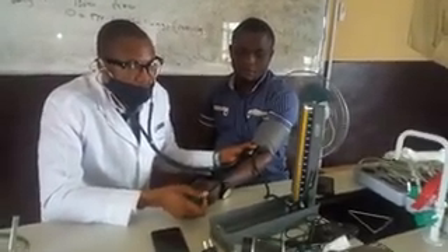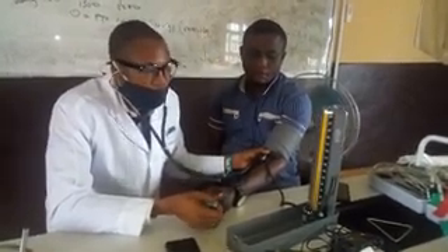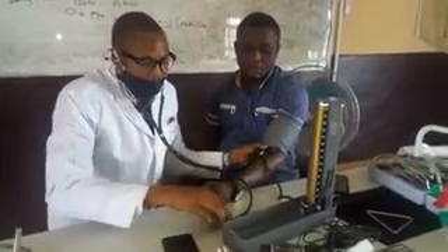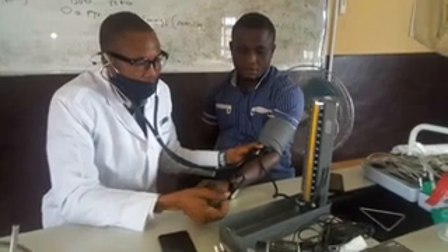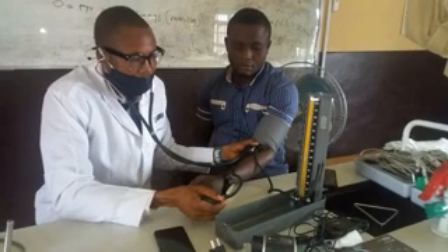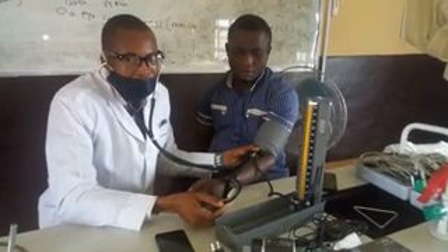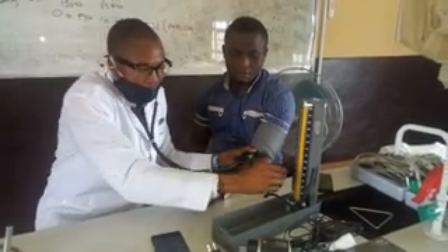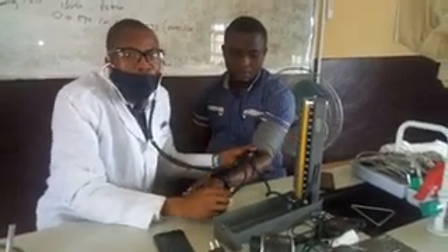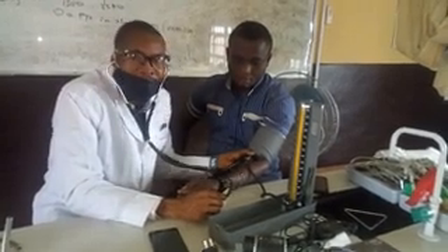Thereafter, add just 20 mmHg more — do not take the mercury to 300. Then start deflating little by little. The first sound you will hear using the stethoscope alongside the sphygmomanometer is called the Korotkoff sound. When you can first hear that sound, that is the systolic blood pressure.